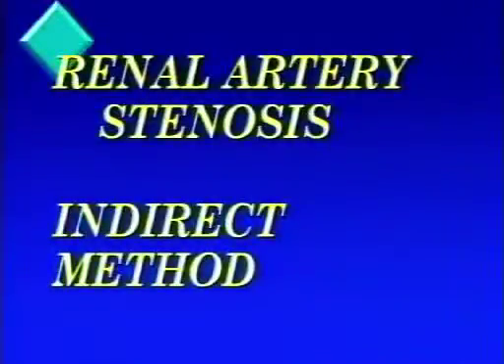Well, the evaluation of renal artery stenosis by the direct method can be very time-consuming, and in the early stages of learning how to do these examinations may take you up to 2 hours to do an examination. And the long examination times, combined with the pitfalls of difficulty in obtaining good Doppler angles and having to evaluate the entire length of the vessel, was motivation for trying to find an alternative method for evaluating these patients that would be a little bit easier technically, but yet provide the same level of accuracy as the direct method that's been around for so long.